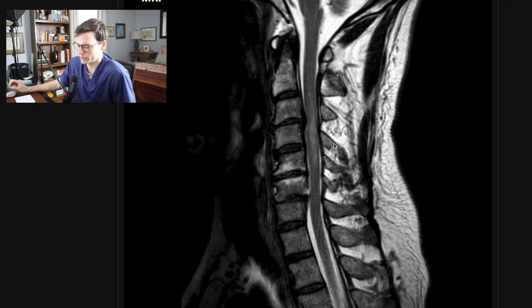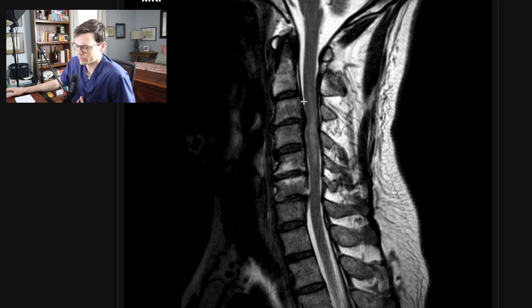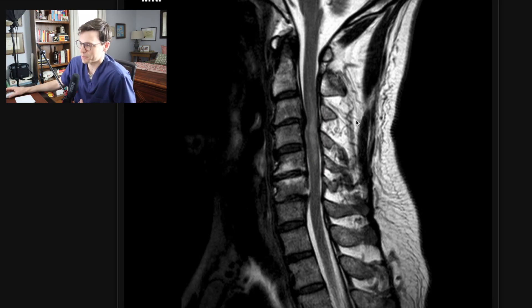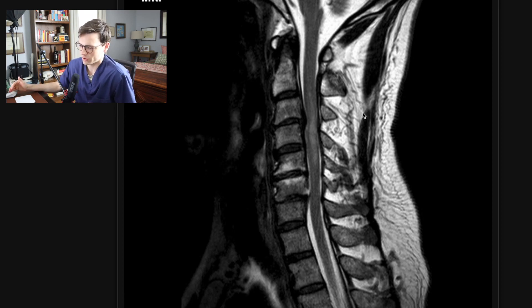In the final case, I have pulled up a sagittal T2. What I want to demonstrate here is cervical canal stenosis and the related cord signal abnormality. Notice this brightness in the cord at this level — there is stenosis here, with the spinal cord being pushed on by what looks like mostly disc. Because the spinal cord is being pushed on, it has this cord signal abnormality. This is an example of compressive cord signal abnormality, and it's an important thing to let the clinician know. Thank you all for watching — the more normal you identify, the easier it'll be to determine what abnormal is.